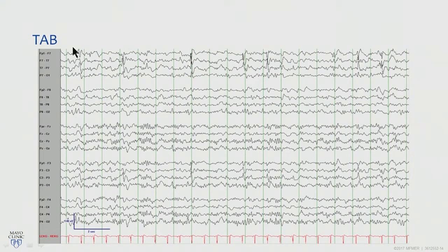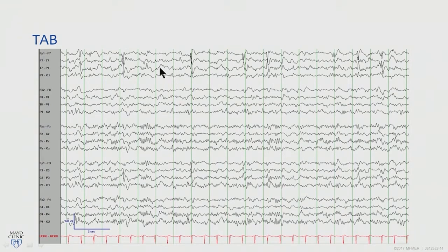This is a bipolar montage, left temporal and right temporal, showing rather abundant epileptiform discharge. These are probably spikes — they have an aftercoming slow wave. The EEG in between is also showing some abnormality and some slowing. These are abundant epileptiform discharges in the left temporal chain, involving more than two electrodes, and you do see some voltage gradient or asymmetry in that same region.